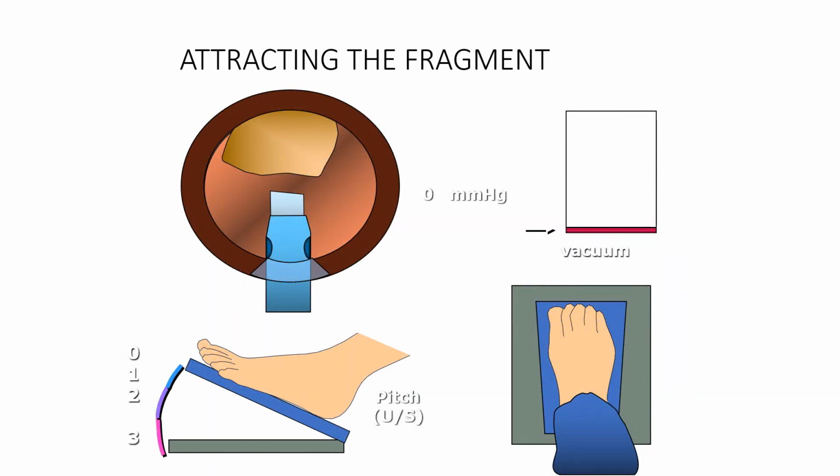So let us put it all together now. In this picture, you see the surgeon is in foot-switch position 0. There is no action now, and the phaco machine is in a resting state. There is no irrigation, and hence there is no aspiration or flow, and there is no power. Vacuum is not generated.